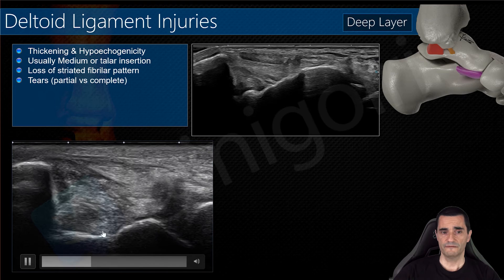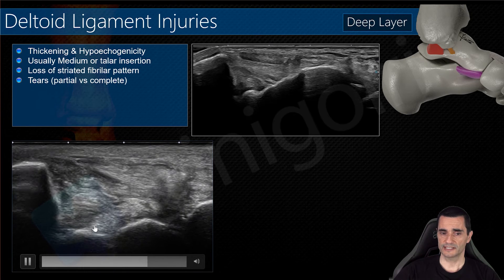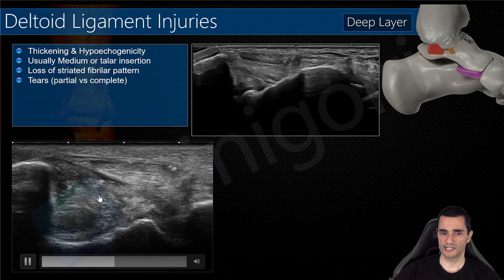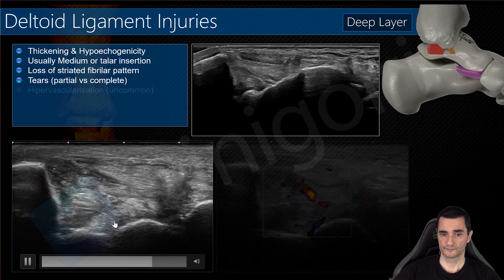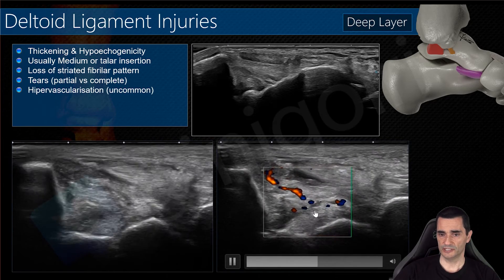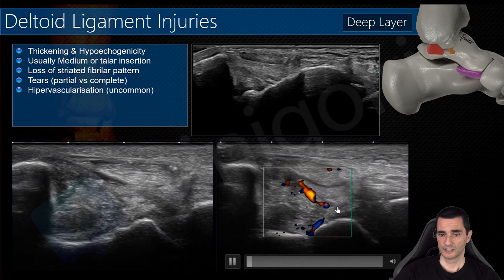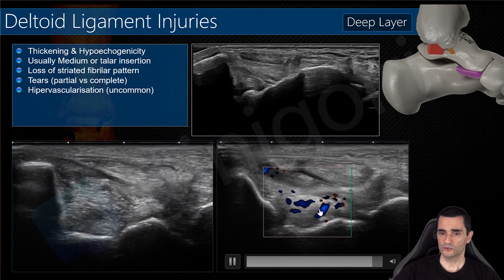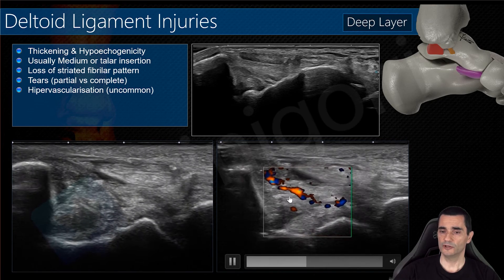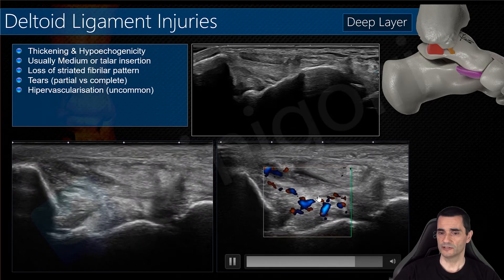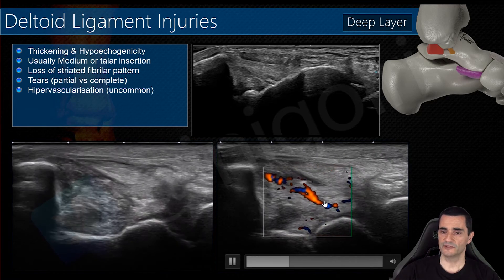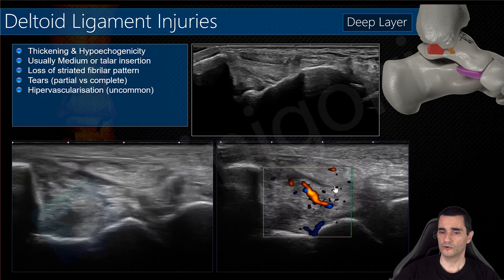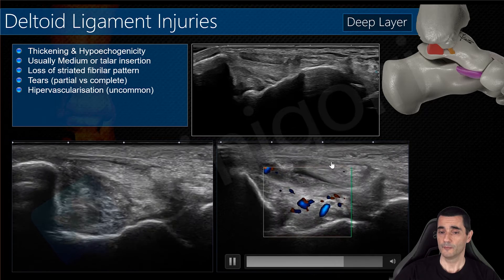We will always find these tears inside the ligament. This is an example of a partial tear of the deep area of the posterior tibiotelar ligament and its vascularization on Doppler. If you want to check the vascularization, always remember to avoid stretching the ligament before performing Doppler, because if the ligament is stretched, the Doppler signal will not be present. Also, don't push with the probe because you will collapse the vessels.